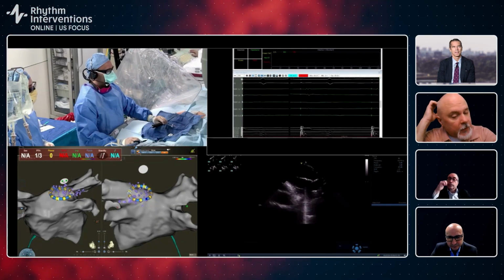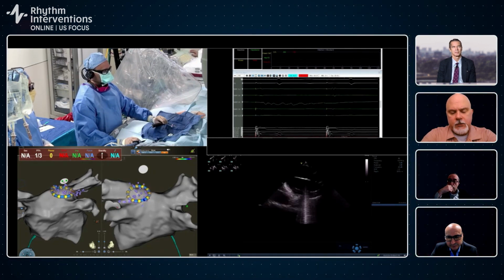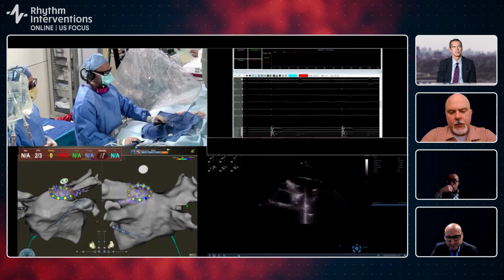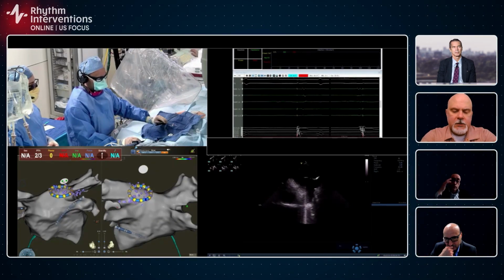Sorry, I was muted. So, Moussa, I was going to ask, how heavily do you rely on intracardiac echo to confirm contact with this technology? Or can you rely entirely on the contact indicators through the mapping system?